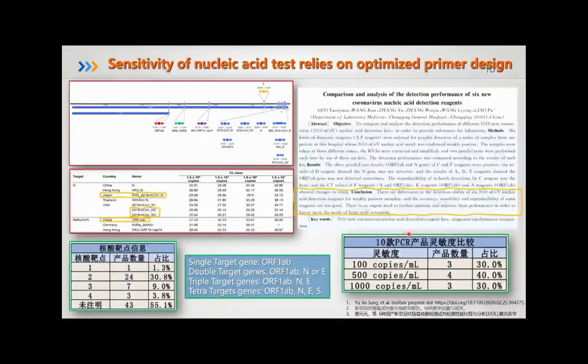The South Korean research group compared the primer and the probe sets for 2019 novel coronavirus that were developed by CDCs in China, Germany, Hong Kong, Japan, Thailand, and also USA. The sequence of primer probe sets for each country are different, and their locations at a viral RNA genome are shown here.